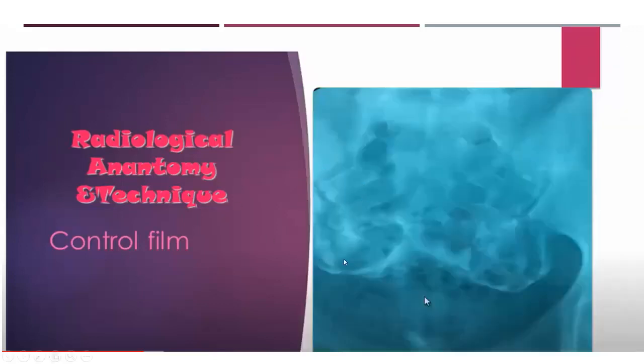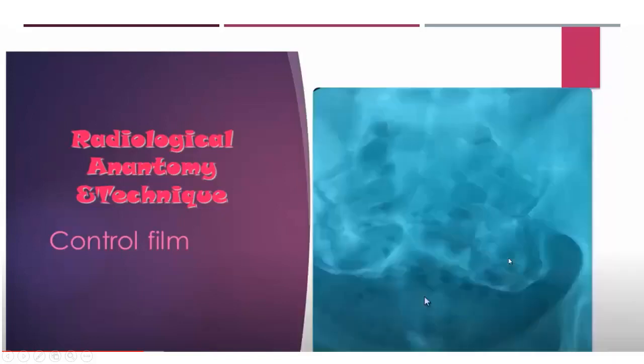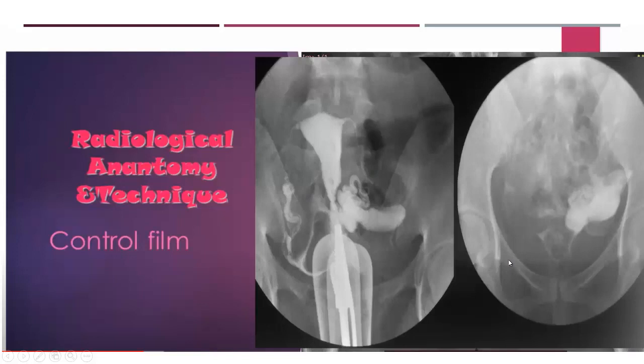We have here delineation of contrast in the, I will get the anatomy once more, but this is one of the pitfalls. This is the normal spilling of contrast in the peritoneal folds. This is not loculation, this is just contrast in one of the peritoneal folds. So this is not loculation, and here again, but this is loculation. See here the peritoneum is distracted upwards like that. So there are adhesions here. So this is peritoneal loculation.